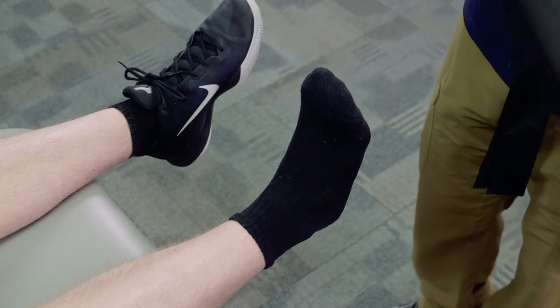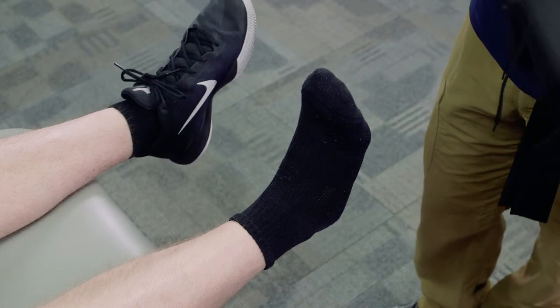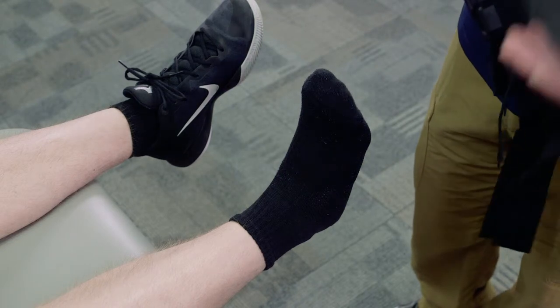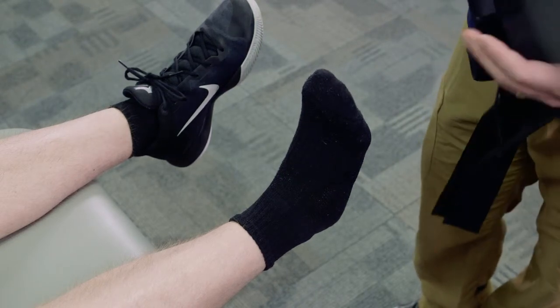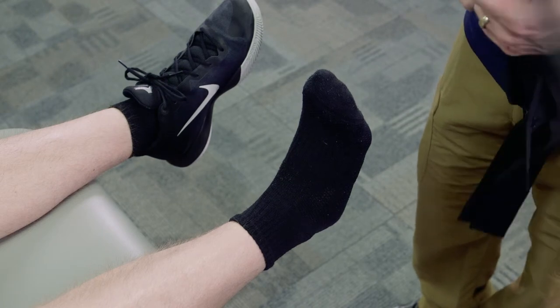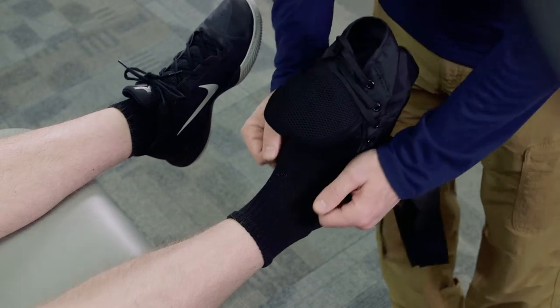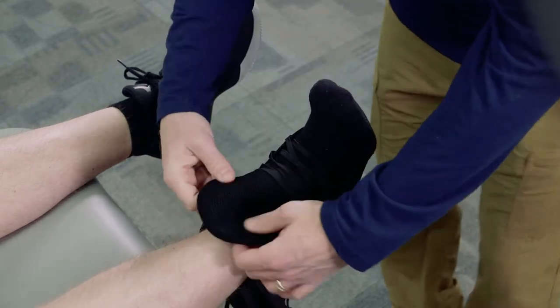Based on the athlete's shoe size is what determines the size of the brace. This individual has around a size 11 foot, which corresponds to a medium or a large, so we're going to start with a medium. If that's too small, we would move up to the large. We place the brace directly over the foot, kind of like putting on a high-top shoe.